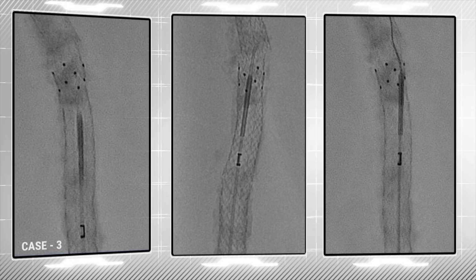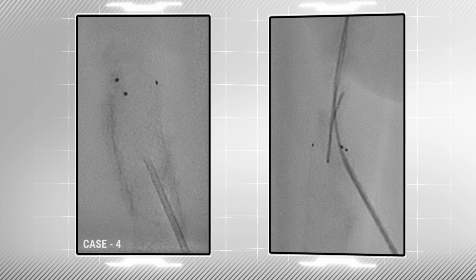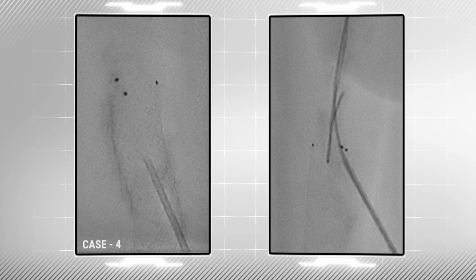upward. In this next occluded stent case, a 21-gauge needle is inserted through the stent struts. The BeBack is then introduced over a guide wire, also entering through the struts and advancing in a retrograde manner to the SFA's proximal occlusion.